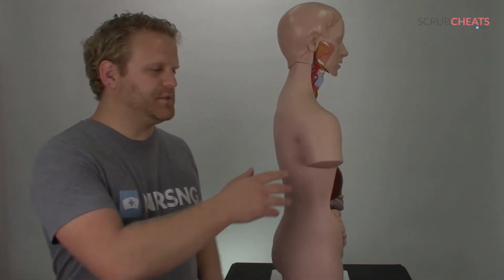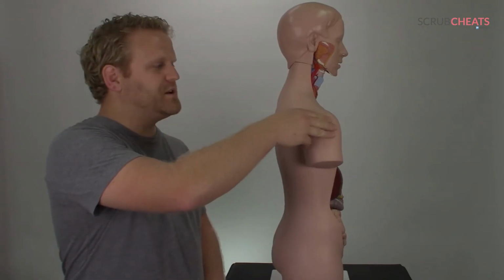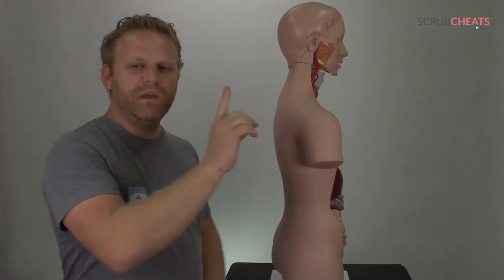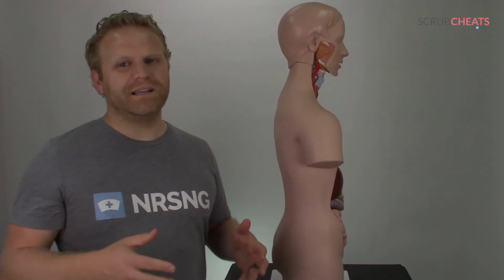The injection site for the deltoid muscle is 2.5 centimeters or 3 fingers below the edge of the acromion process. For this site, use 1 mil of medication and a 1 inch needle. This site has the most variance based on the size of the patient.